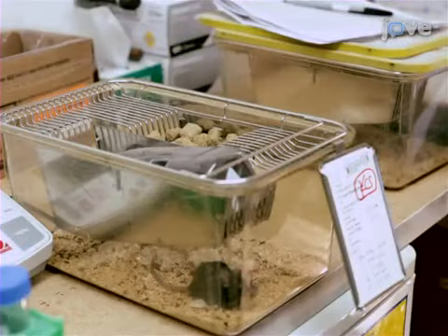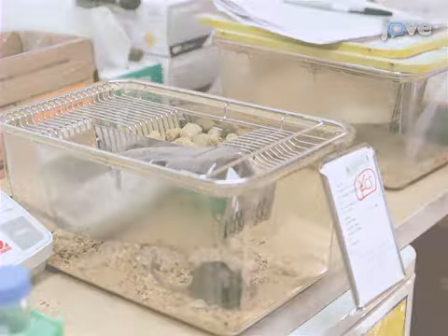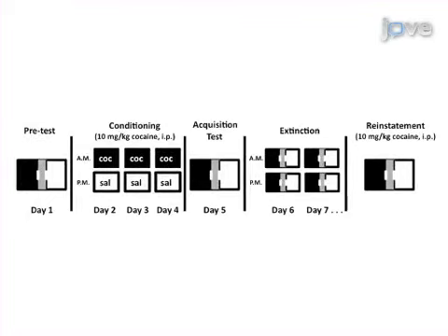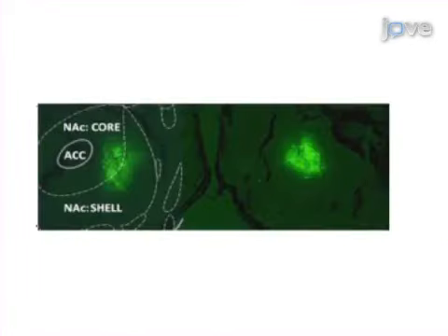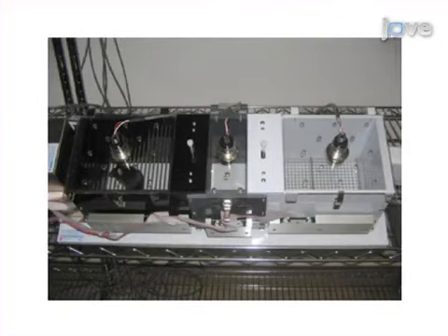Next, the mice are allowed to recover in their home cage for 10 to 14 days for maximal Cre activation. The third step of the procedure is to test the mice in conditioned place preference, including the acquisition, extinction, and reinstatement phases. The final step of the procedure is to perform a histological examination of microinjected mice to validate correct microinjection placement. Ultimately, results can be obtained that show changes in acquisition, extinction, and/or reinstatement behavior in response to gene knockout through conditioned place preference behavioral testing.